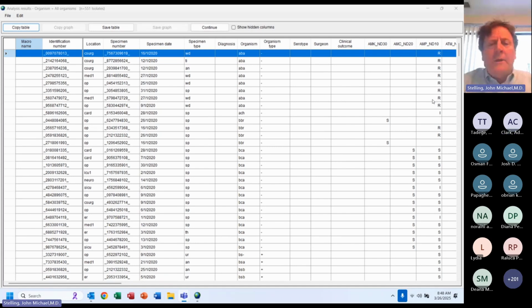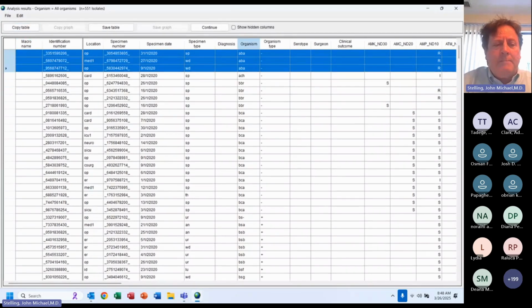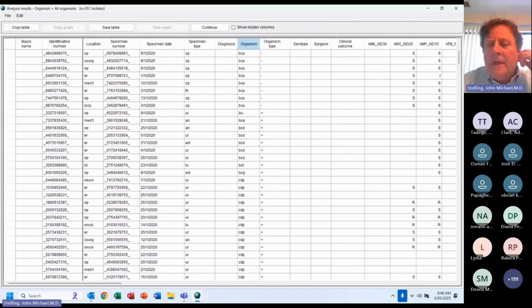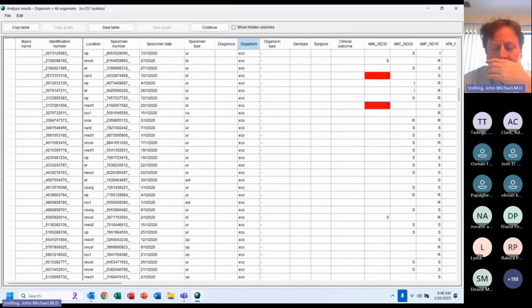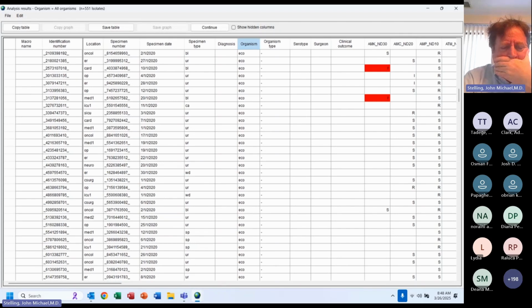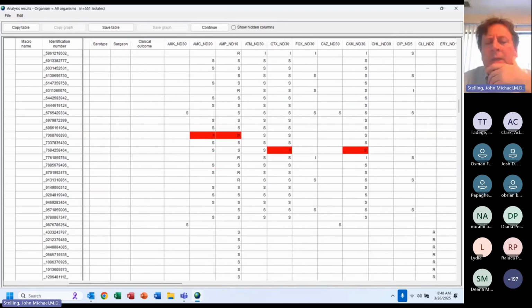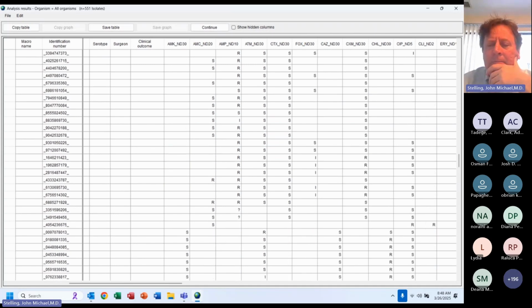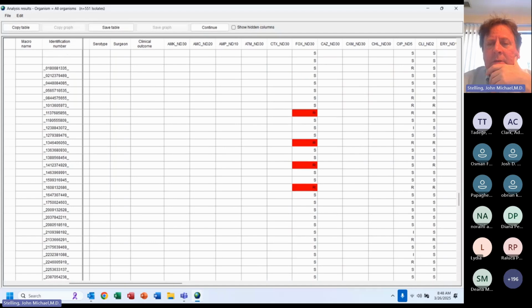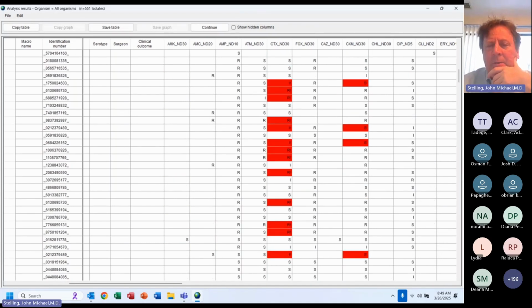Perfect. So here you see the bacteria in alphabetical order. This top block here is Acinetobacter baumannii. You see the patient details on the left. If I scroll down, eventually you'll see that some of these appear in red. Let me go a little bit more to the right so you can see more in red. So anything in red is unusual or important, unlikely, and those are the alerts. Let me go up there. There's another section. Yeah, here's the section I'm looking for.